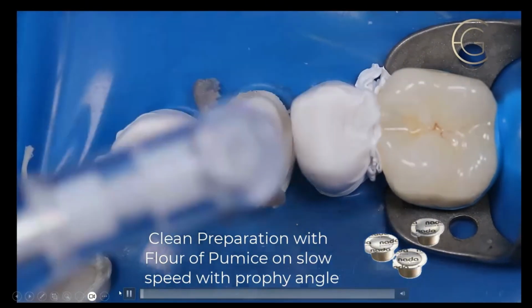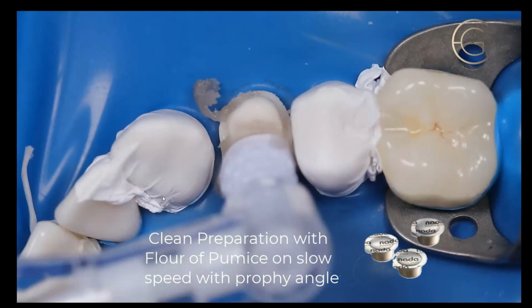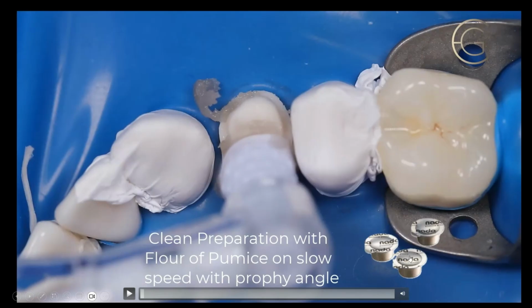We're going to pumice this off. Now, here's the deal. You take off your temporary, maybe you have it with Duralon. It's really hard to get off. The Katana Cleaner really does a great job of cleaning that off. Or you could pumice this, but make sure that you don't use a hygiene paste with fluoride. You cannot use it with fluoride. Okay, it really affects the bonding. So you want to clean this off really well.